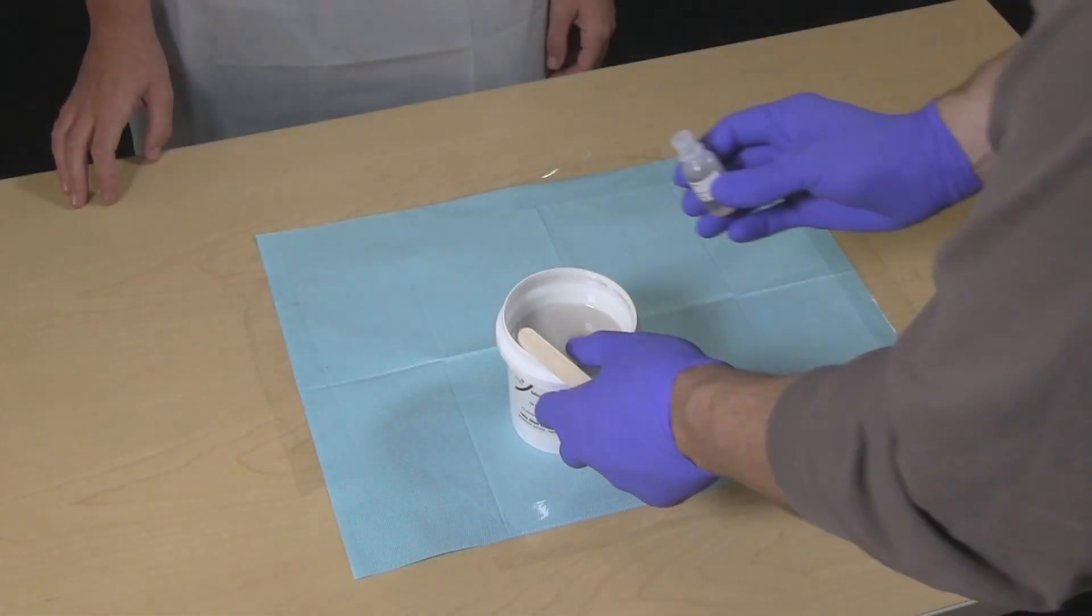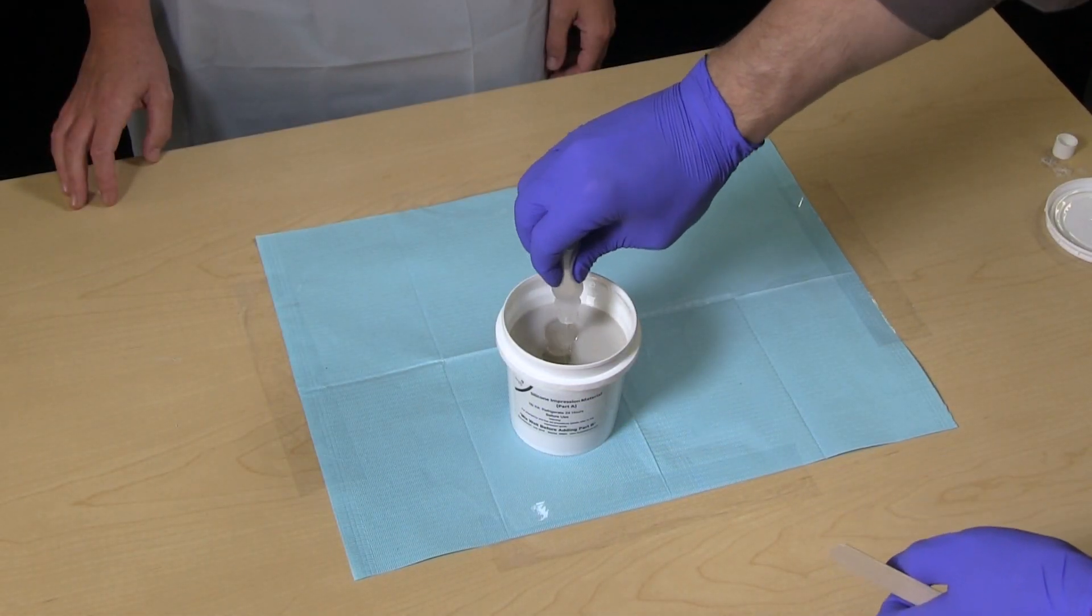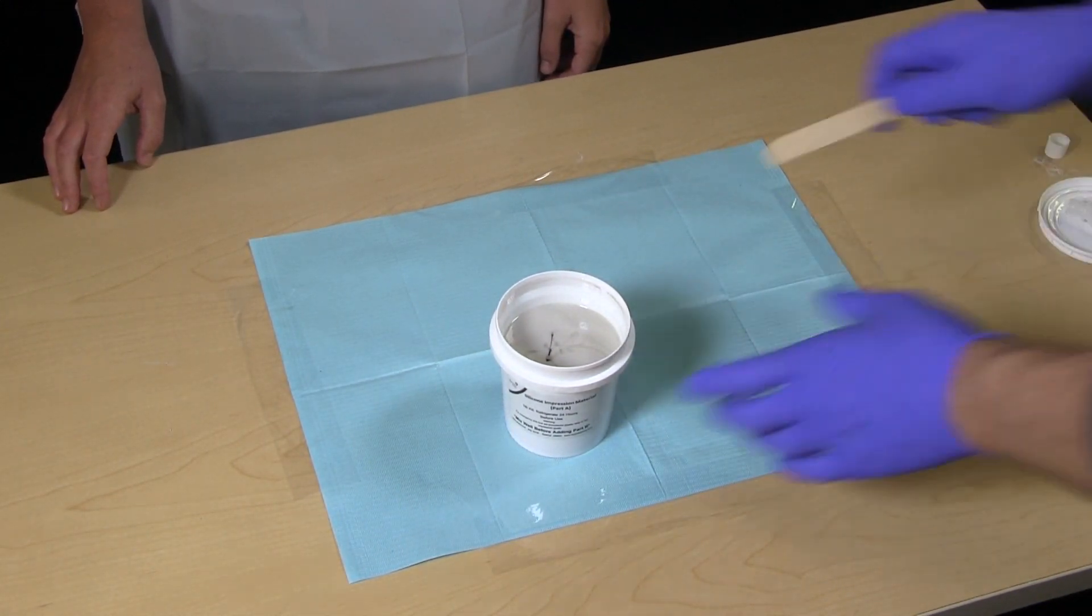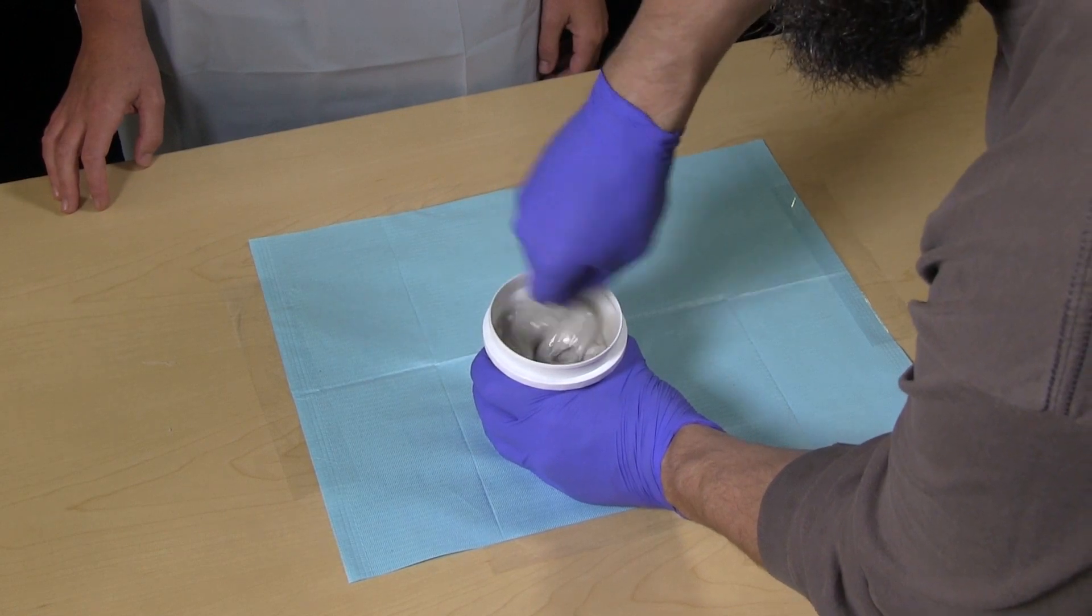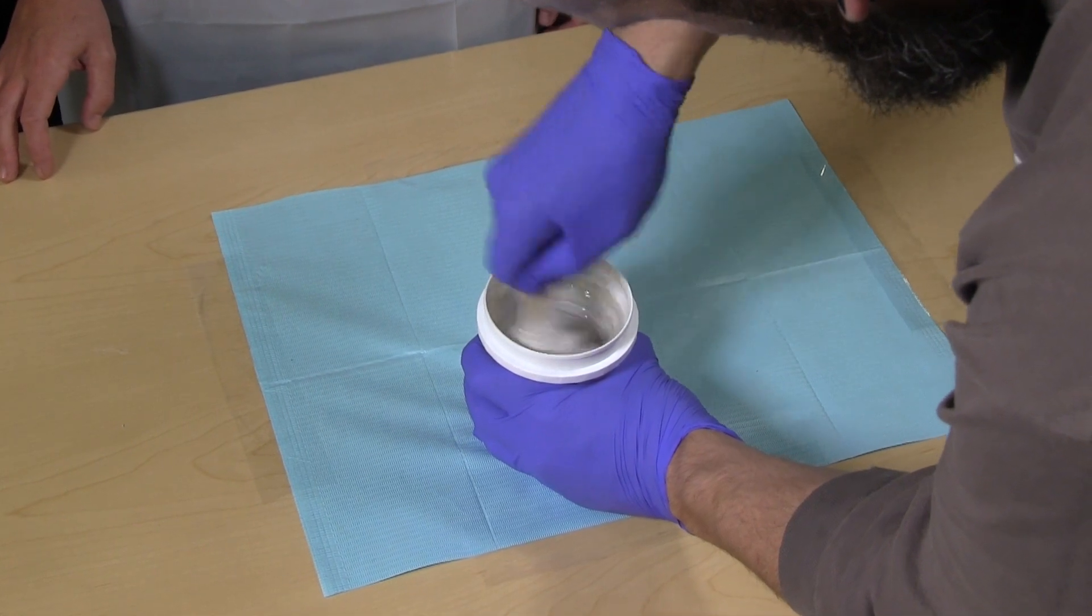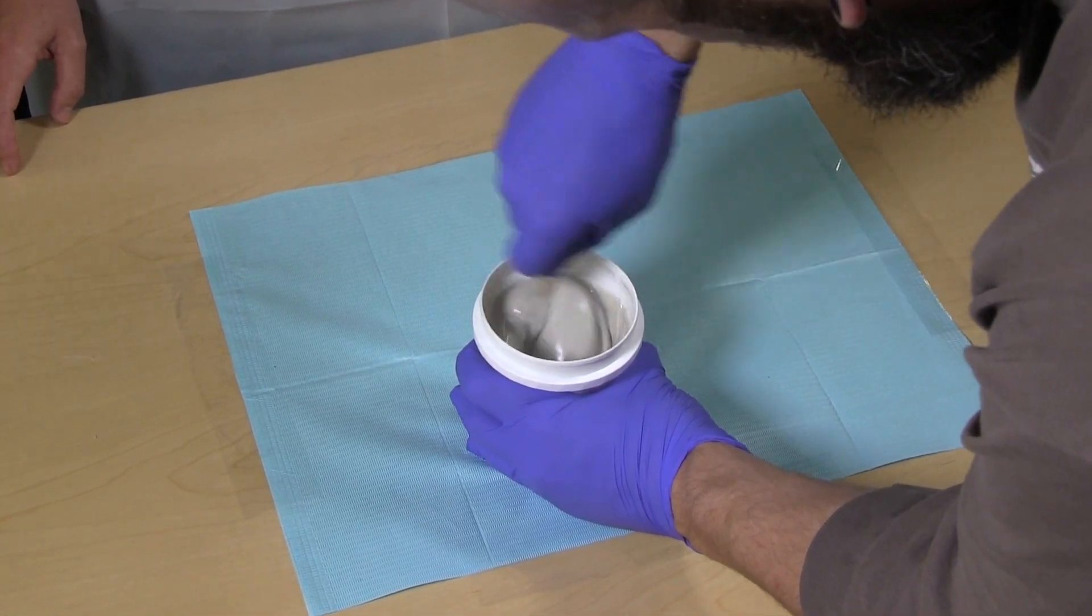Add one bottle of catalyst to one container of impression material and stir thoroughly. An uneven mix can result in uncured material. The work time is approximately 3 to 5 minutes. In warmer temperatures, this time will be reduced. Impression material should be refrigerated to increase work time.